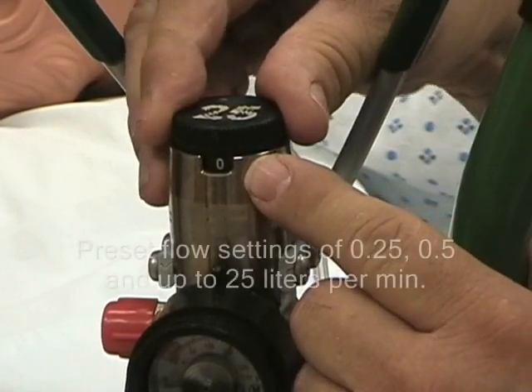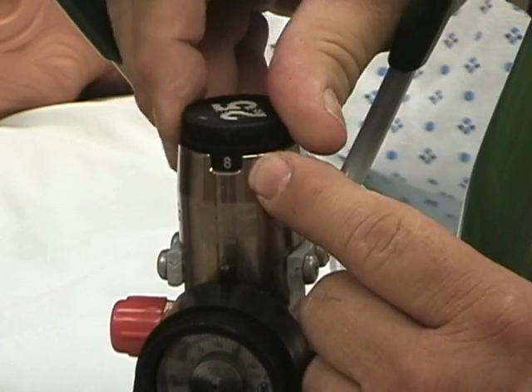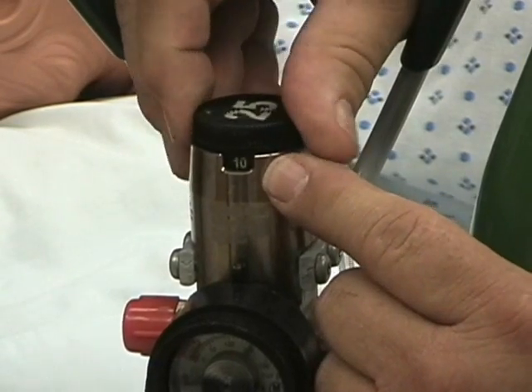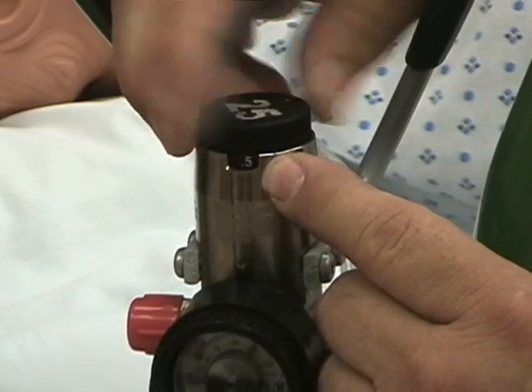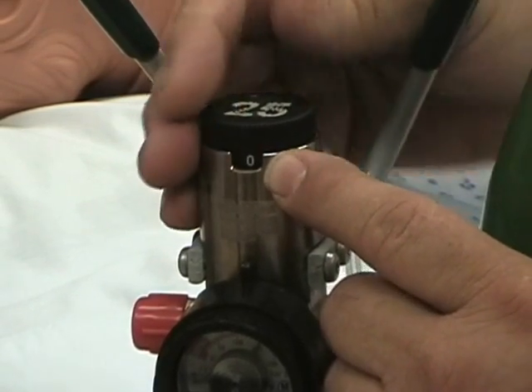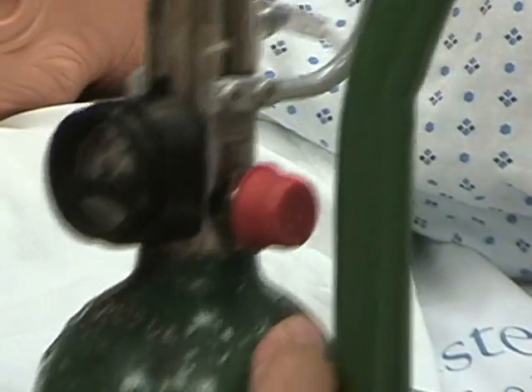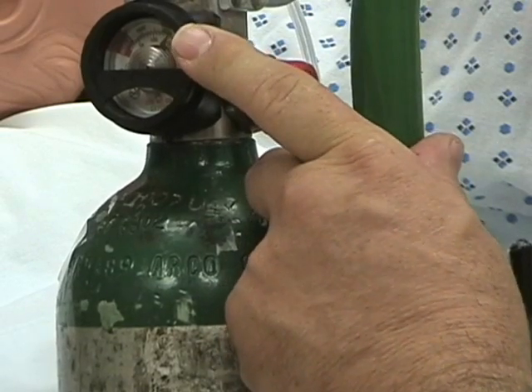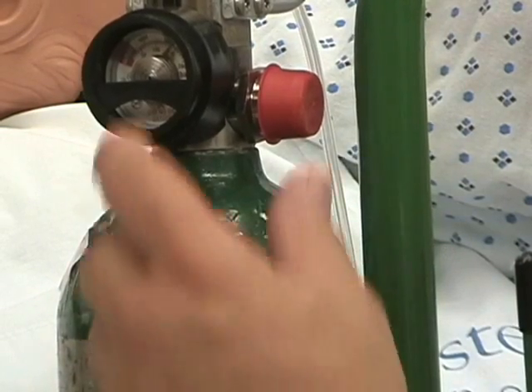Here you can see the flow is at zero, and as we turn this we can increase the flow typically in one-liter increments until you get to four, then it goes to six, eight, ten, and up to twenty-five. The lowest flow other than zero is 0.25 and 0.5 for extreme low flow oxygen. Down here is the pressure gauge, which shows you how full the tank is and whether it is getting close to the point where it should be refilled.